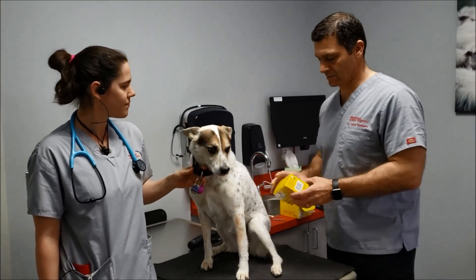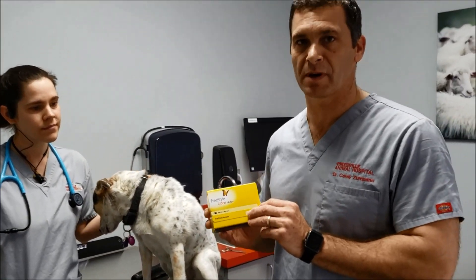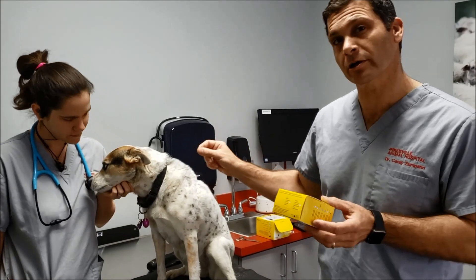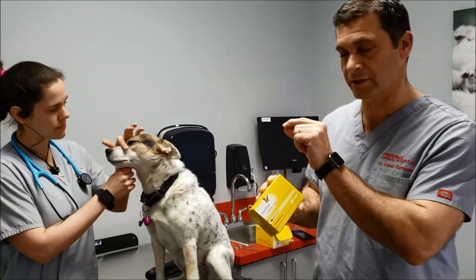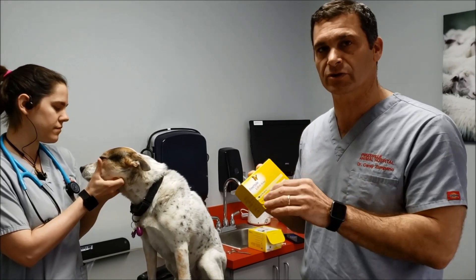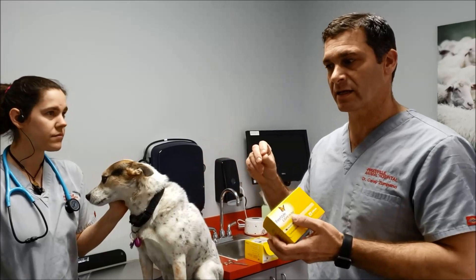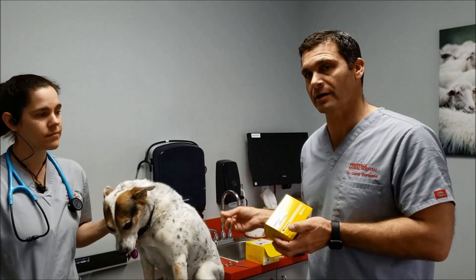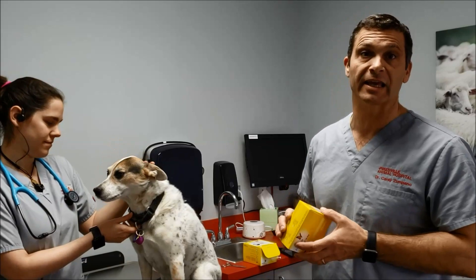This is a Freestyle Libre — what's called a continuous glucose monitoring system. As opposed to checking blood sugar which tells us right then and there what the level is, this is a little unit you attach to the skin with a tiny needle that goes into the tissue underneath the skin and checks blood sugar in the interstitial space every 15 minutes for 14 days. It gives us a lot more data points and information as to what's going on with any given patient at any given time.